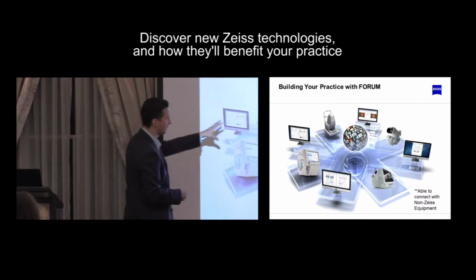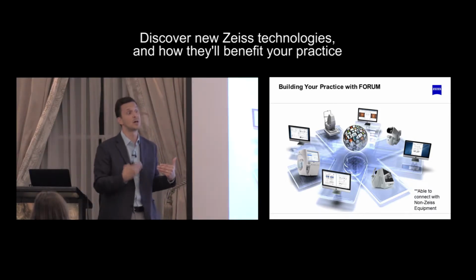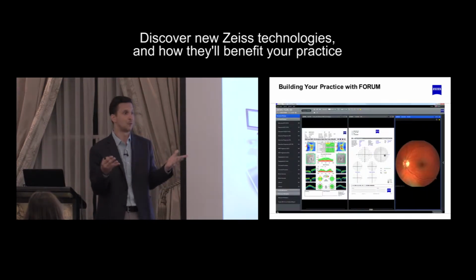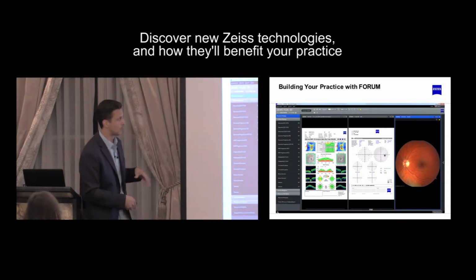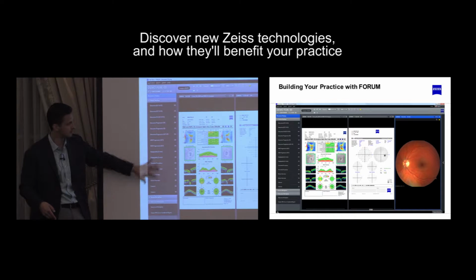So it can connect different devices, and there are other devices which create impediments, and these are usually based on the way in which another product manufacturer will allow that DICOM data to be used within Forum. Forum is not a diagnostic device in and of itself. The way Forum works, or it's laid out, you've got down this side is the patient name, and these are basically sets of clinical displays that you can put up.